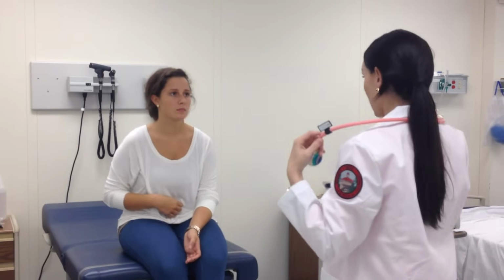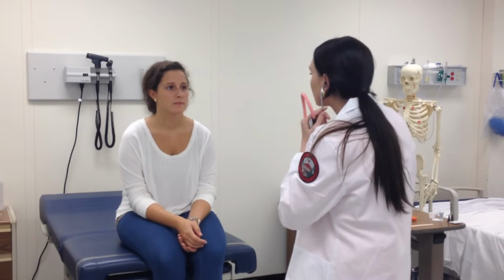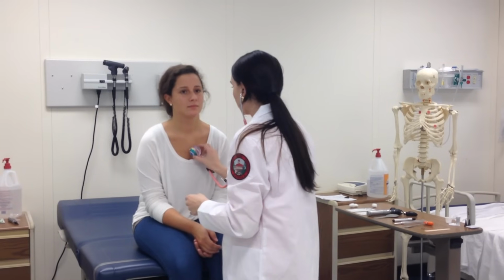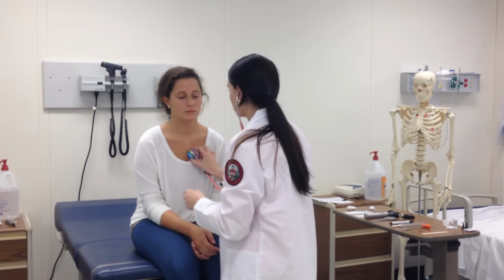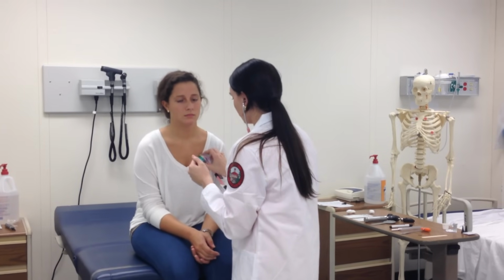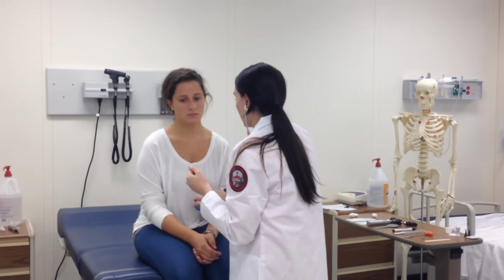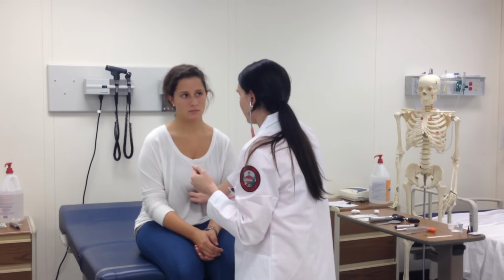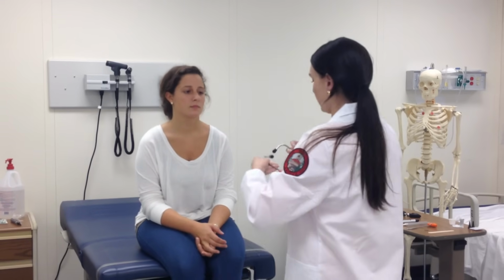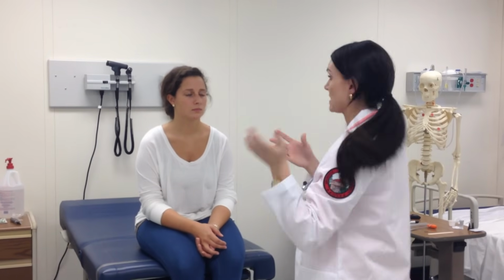Now I'm going to listen to your heart sounds. Warm it up for you. You have your aortic at your second right interspace. You're going to have your pulmonic at your second left interspace. Your tricuspid at your left sternal border. And you're going to have your mitral at your fifth interspace, midclavicular. Your fifth left interspace, okay? Good. I didn't hear any murmurs or any irregular beats.